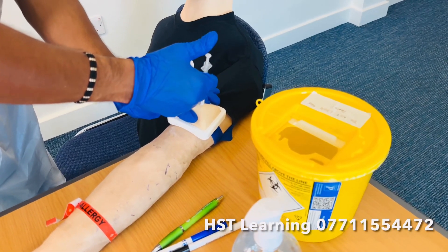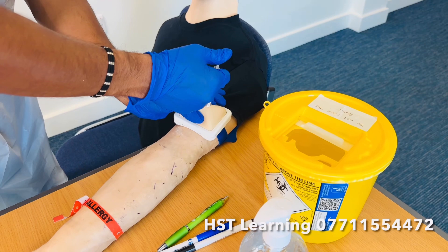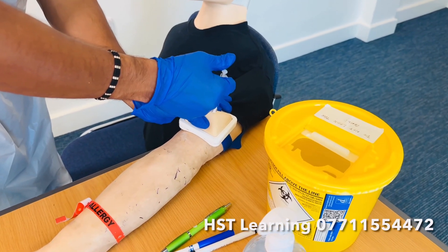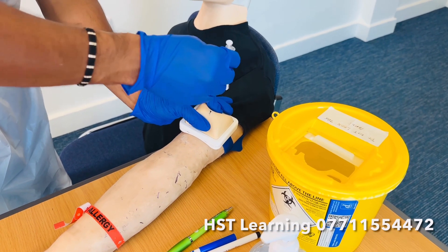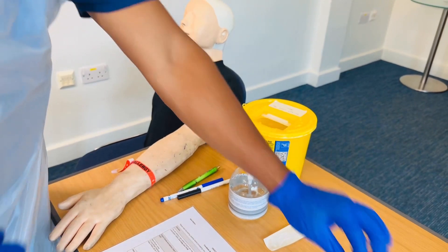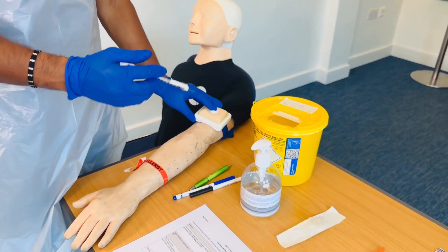Pinch and hold the skin — because it's a subcutaneous injection — and insert at 90 degrees. Give the medication slowly over 10 to 30 seconds. Then remove the needle, let the skin go, and apply the cotton swab with gentle pressure.